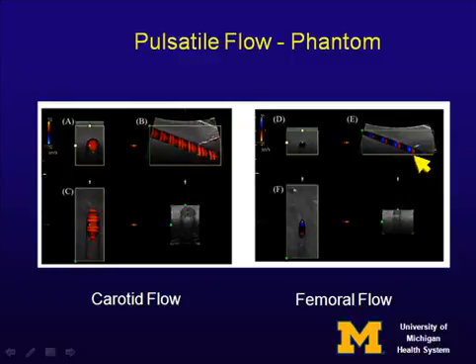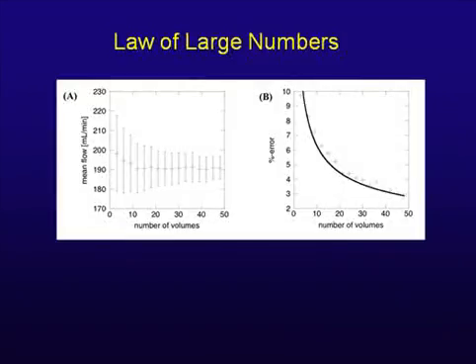flow in the simulated femoral artery. You notice in this one particular cross-section there's no flow, because remember the flow is crossing zero several times. In the longitudinal scan you can see it's forward and backwards, represented by the red and blue, and zeros all the way down the blood vessel. And in the C-scan there's red and zero and blue. None of this matters. It all works fine as long as you can sample long enough. That's the problem with pulsatile flow.